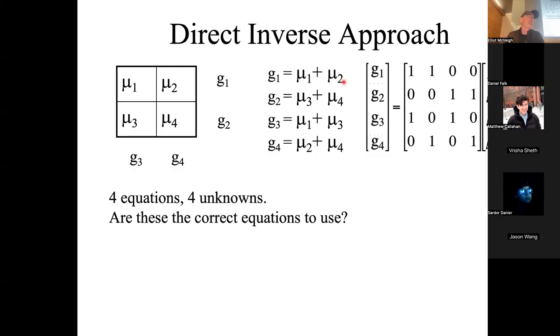Interestingly, if you're really good at linear algebra, which I'm not, I'm just average, you look at this set of equations and you would say, something's wrong here. I can derive one of these equations from the others, right? So one of these equations, or all of them actually, is dependent on the 3 others. I can just make that equation. And so we don't have enough information with this set of measurements to solve for the mu values because of that dependence. In linear algebra, you say this matrix is not full rank, right? It doesn't have full rank to do this inversion.